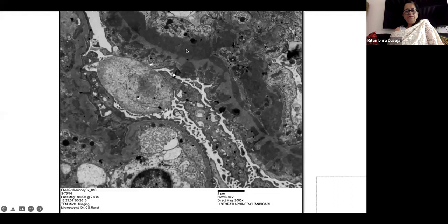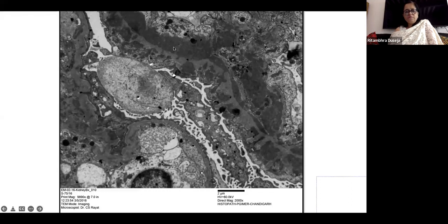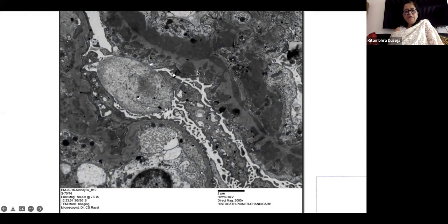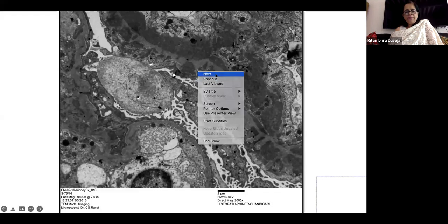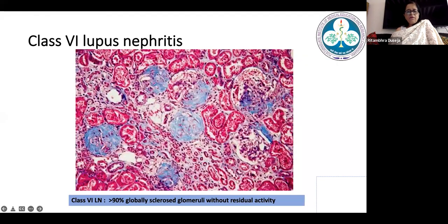On EM, a picture with class four wire loop lesions can simultaneously show massive sub-epithelial deposits in the same loop — something very classically seen in lupus nephritis.